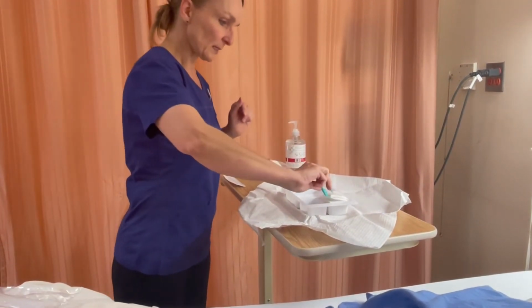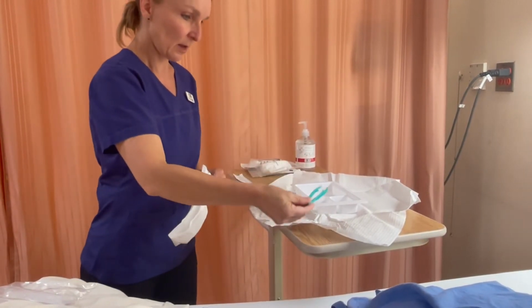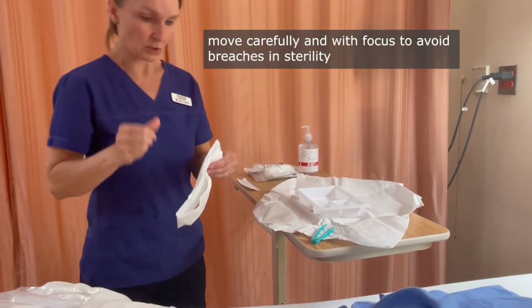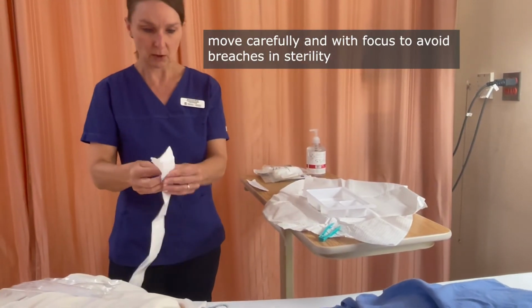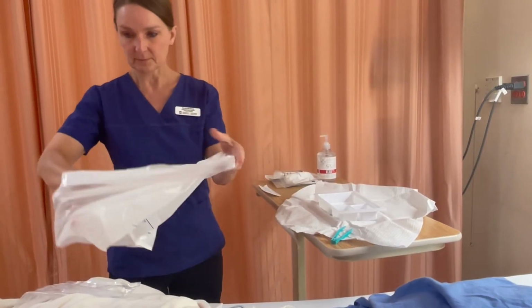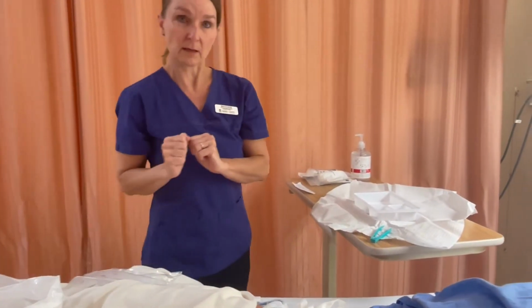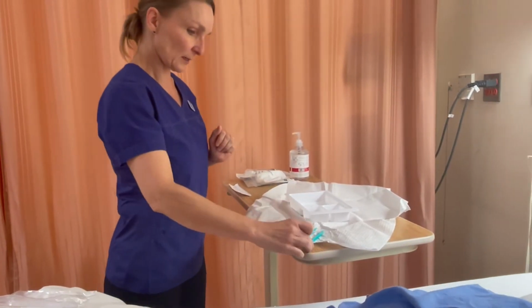Now I want to pass myself several supplies and add to my wound care kit. I'm placing this within my 1-inch border, and I'm opening up my garbage bag, which is nice and large in this case. I've asked my patient if it's okay to set it in their bed, and they are good with that.